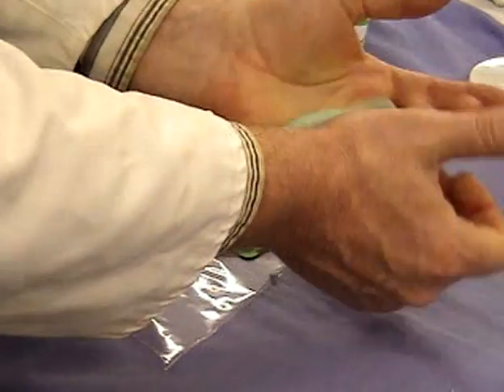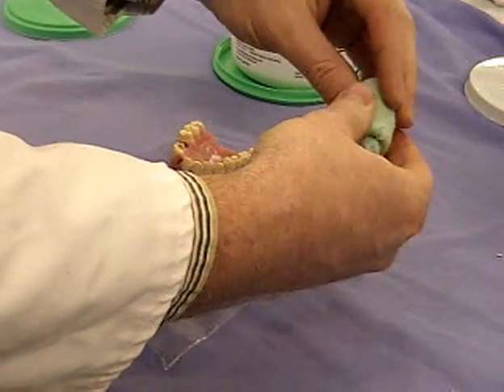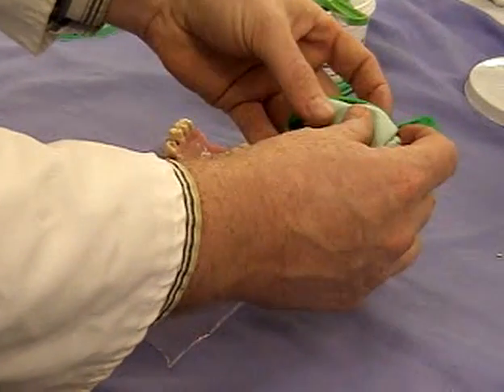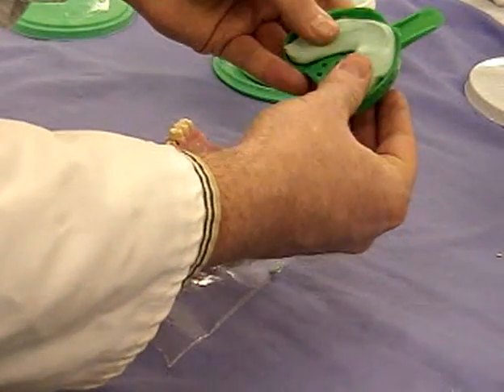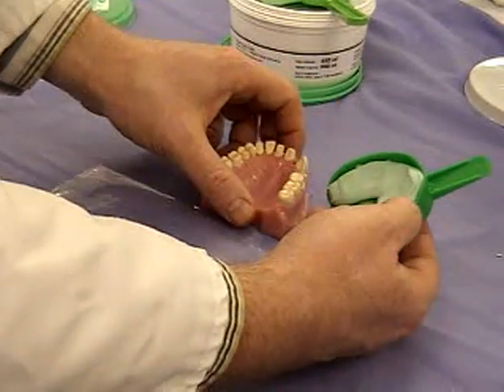You've used equal portions of the heavy-bodied putty — it's a putty-based material and a putty catalyst — and you mix them together and blend them using your hands. We're just going to use a regular stock tray for this. There's probably not quite enough material; we should have a little bit more at the back.